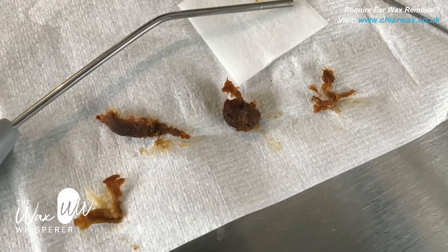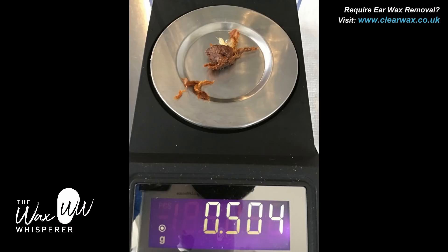And there are the remnants of the left ear wax or tissue. You can see the quite large plugs. And I believe I also weighed it — yes, there we are. So it's just weighed in at over half a gram. So quite a big haul there.